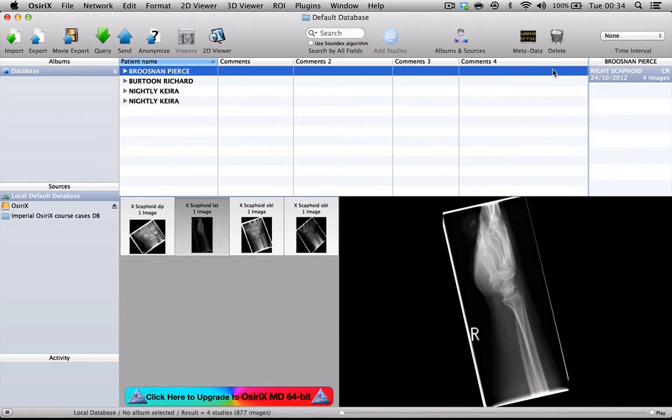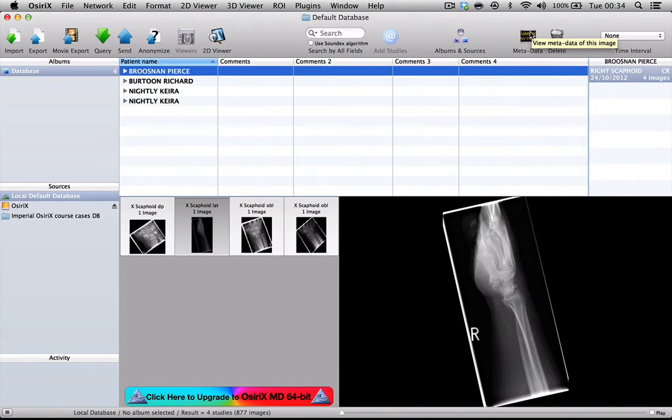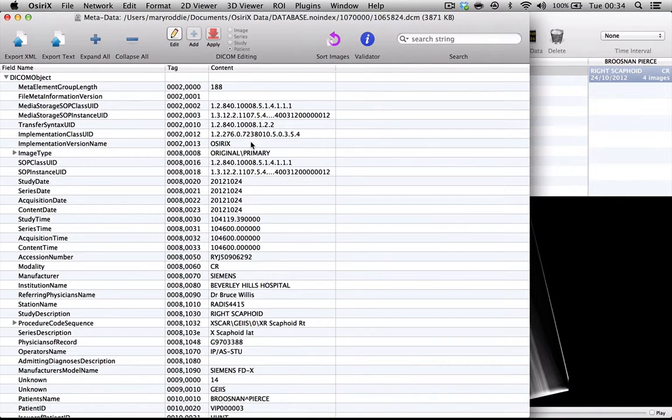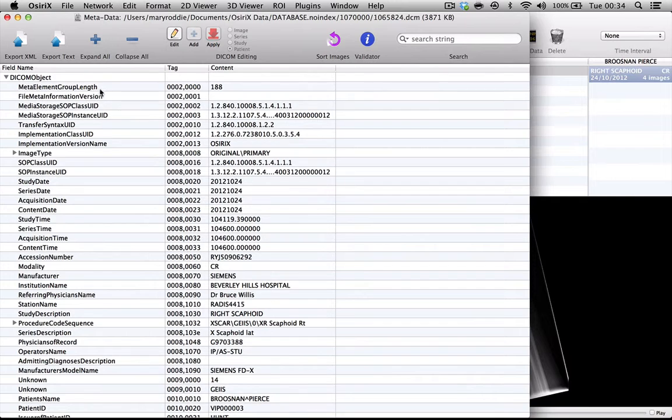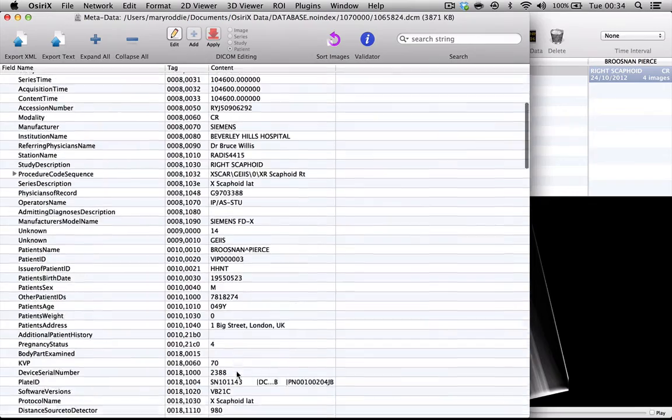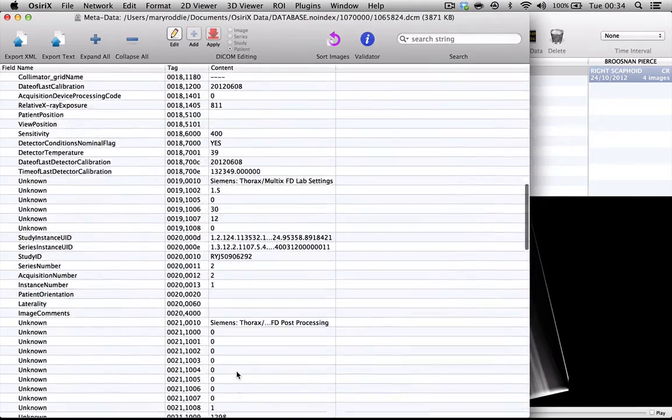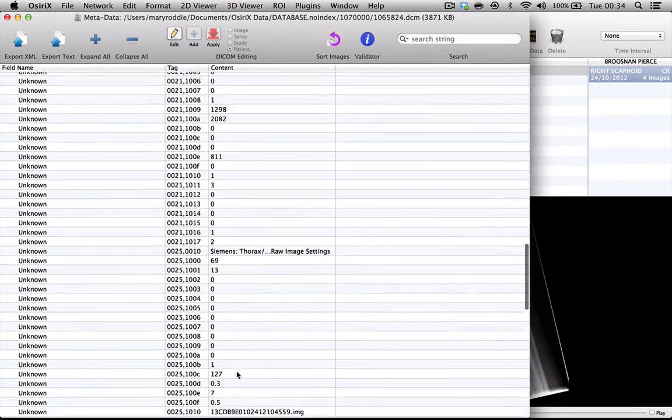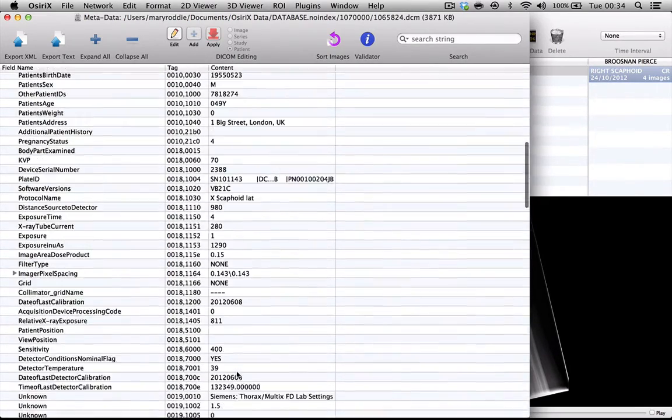If you go into the top toolbar you will see something called 'view metadata of this image' and if you click on that you will see a long list of numerical values with an associated DICOM header name and values in the content column. There are lots and lots of these associated with each patient.